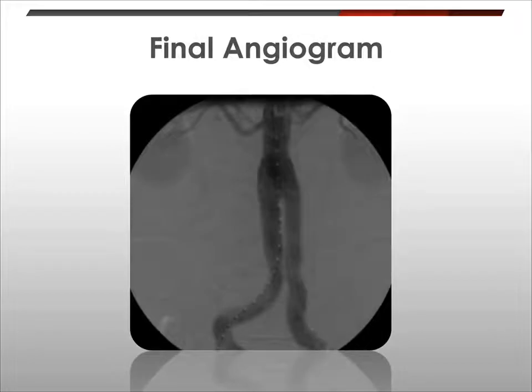And in the final slide, you see the angiogram with the nice long neck, the stent graft in place with no significant limb stenoses or kinks on angiogram, which we've confirmed by intravascular ultrasound, and we know we've gotten right down to the takeoff of the internal iliac arteries bilaterally, both on the final angiogram, which is sometimes difficult to see because it's an anterior-posterior picture, but certainly we confirmed that by intravascular ultrasound, as you saw above.